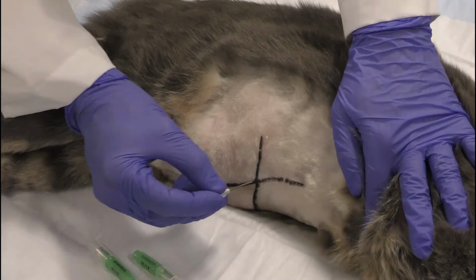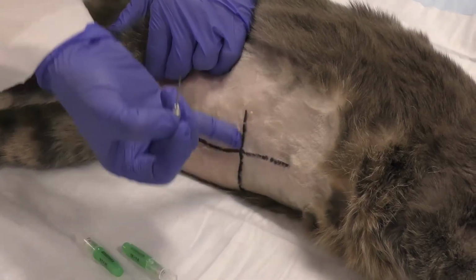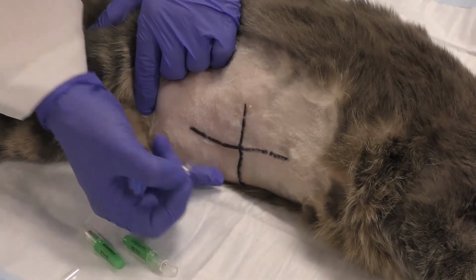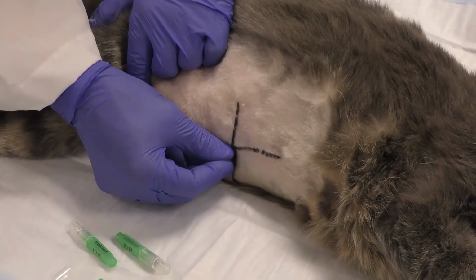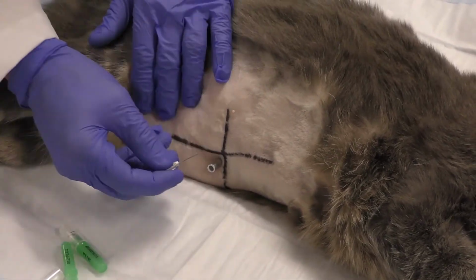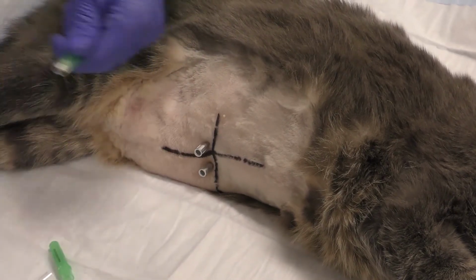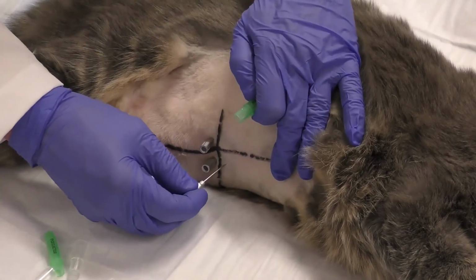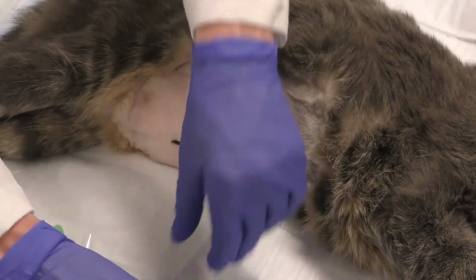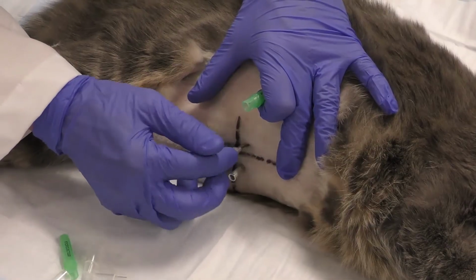Aseptically prepare the skin. To create the 4 quadrants, imagine 2 lines, one along the ventral midline and the second perpendicular at the point of the umbilicus. Firmly but gently insert an 18 or 20 gauge 1-inch needle to its hub 1 to 2 centimeters from the umbilicus within a quadrant. If there is no effusion, continue adding a needle to each quadrant until effusion is produced from 1 or more needle hubs. Gently twisting the needles can promote flow.